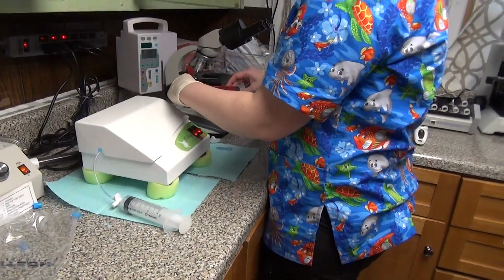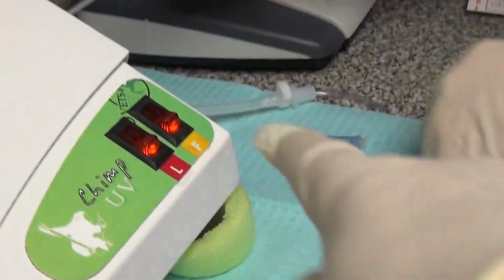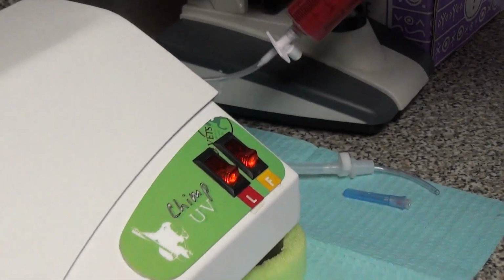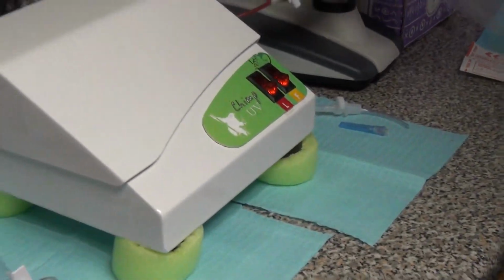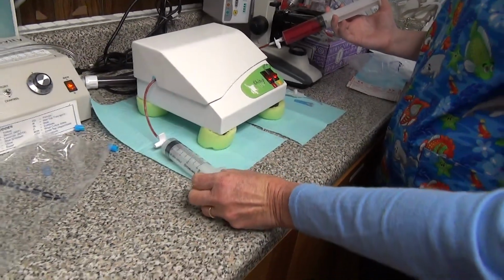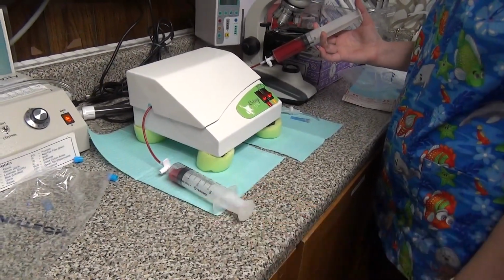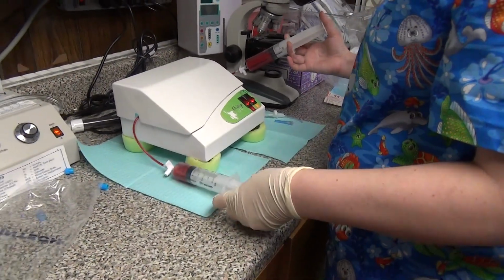So now she's disconnecting and putting it in, and what you want to make sure is that the lights are on, and so the UV light is on, and it's been on for 1 or 2 minutes or so, so it's heated up. And as she's pushing that in, you can actually use this one to slightly pull so that there's a little bit less tension on it if you want to do that. So you can seesaw it with the other hand and bring it through.